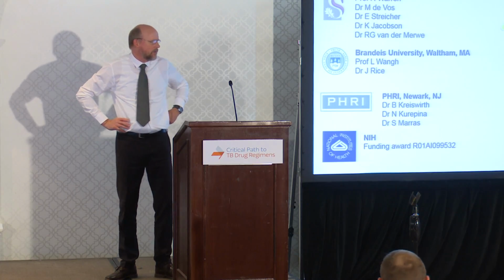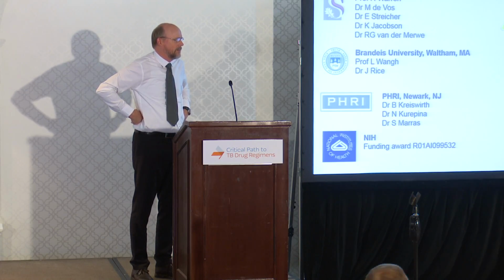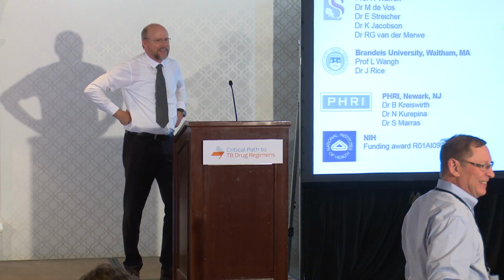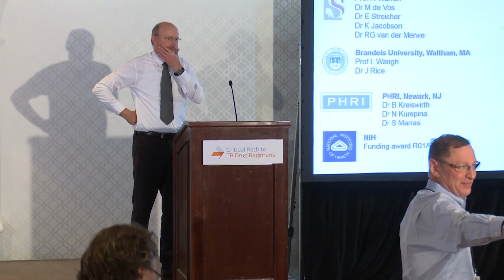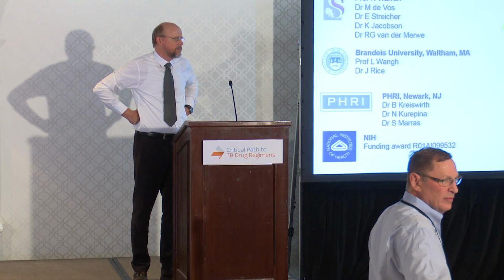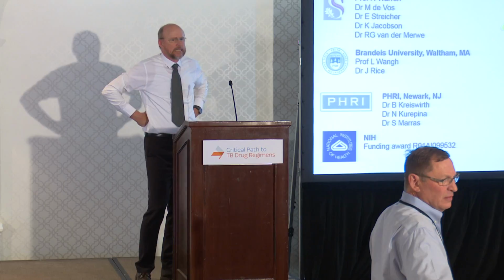Yes, I have one question here. So in your probe design, how long are your probes? I'm going to hand you over to Larry. Depending on the test, the probes tend to be about 25 nucleotides long for the XDR assay that Rob was talking about, but for the pyrazinamide assay, the on probes are 25 nucleotides, and the off probes are about 15 nucleotides long.